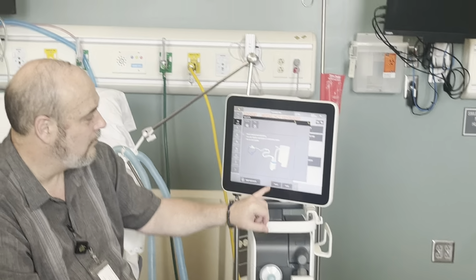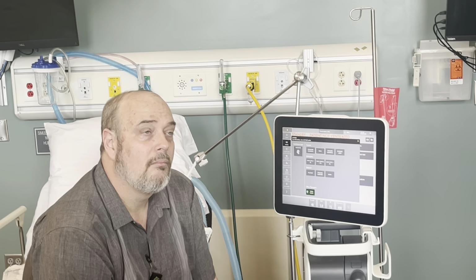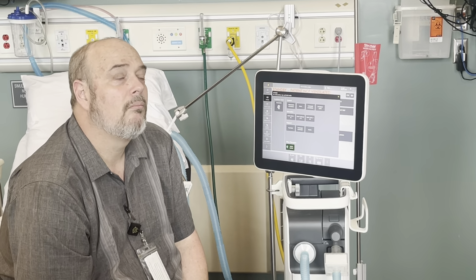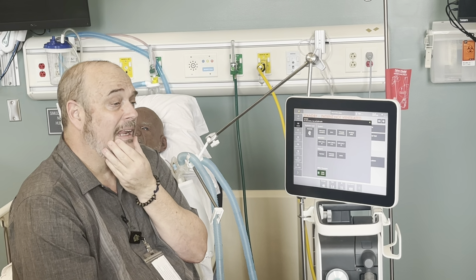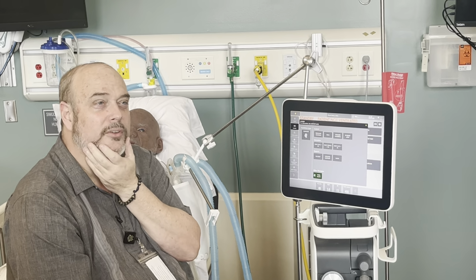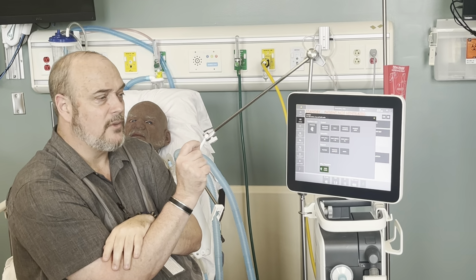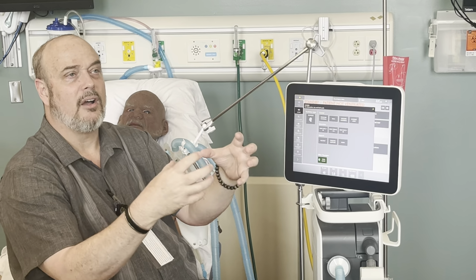I have a question about the I:E ratio. Yeah. So, like, I guess a normal patient who doesn't require ventilation, the I:E is 1 to 3. So my question is why with ventilation it's 1 to 2? Well, generally with 1 to 2, and I'll tell you, there's a lot of variation on that. Generally with a rate, so we'll set the rate at 16, and it breaks down, so it doesn't actually measure out. So if you set this to 1, you may have a second and a half to 2 seconds, and generally 2 seconds is enough for the lungs to get all the air back out.